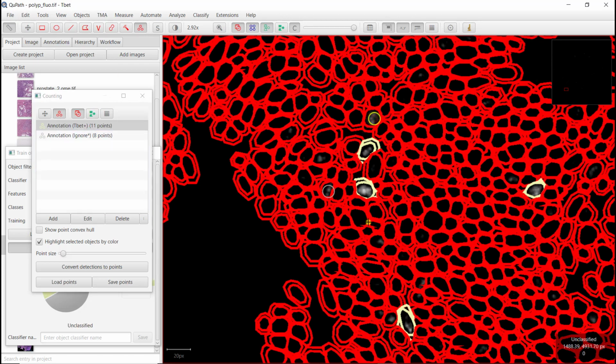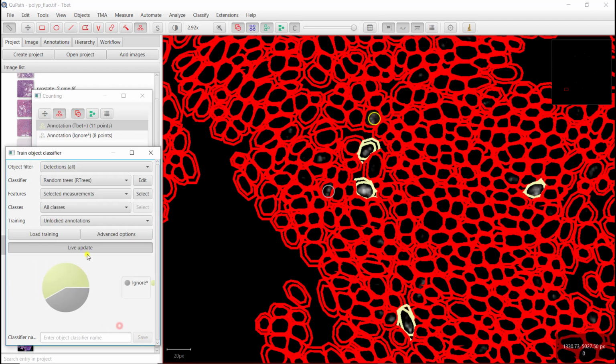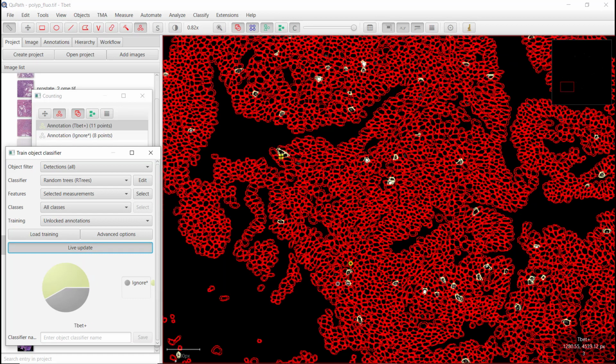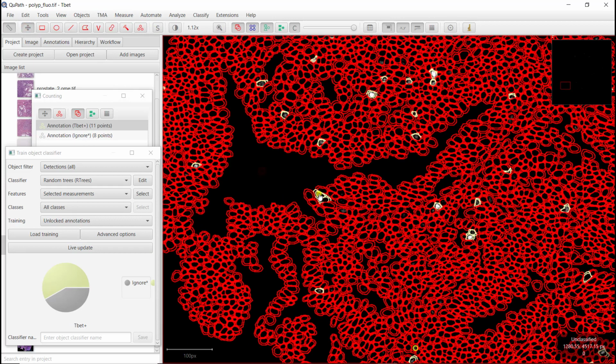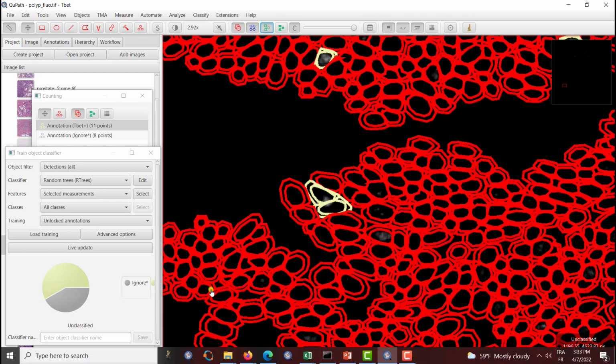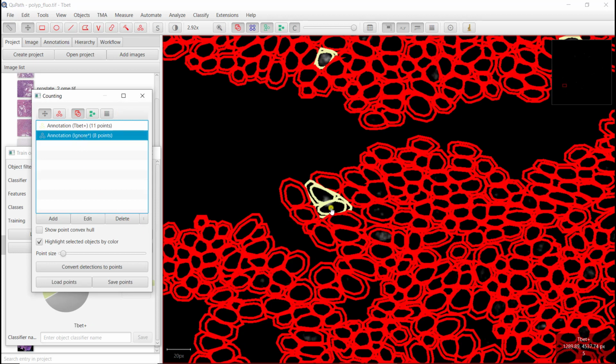But what is important then is to make sure that you know your markers. And here it's a difficult exercise. Here it's a correct one, but it's just a segmentation that wasn't correct. Maybe we can just say that this should be ignored, and all this shouldn't be ignored.